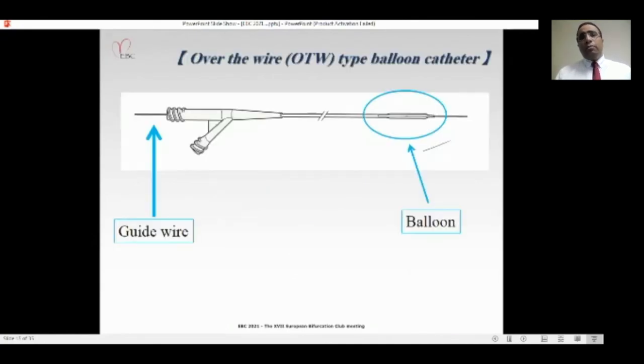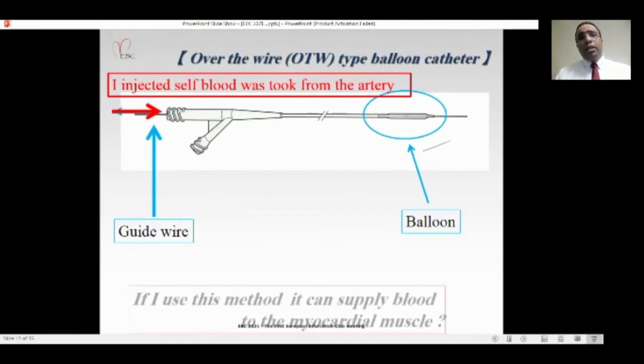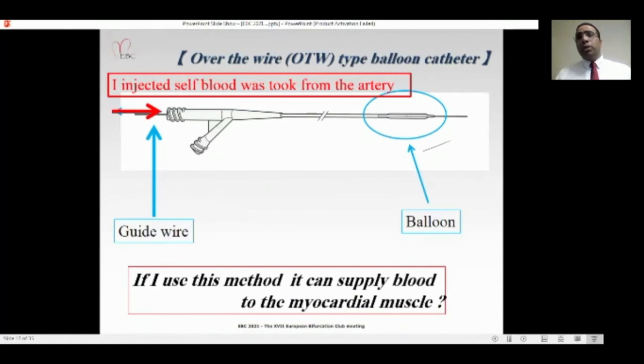The over-the-wire balloon, as we see here, has two lumens: a lumen for the wire and a lumen for inflation. So I pulled back the wire. I injected self-blood in this lumen, and in the other lumen I inflated the balloon, to block the site of the perforation while maintaining distal perfusion to the myocardium.